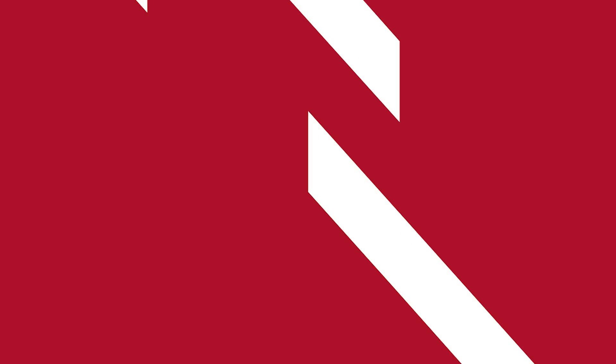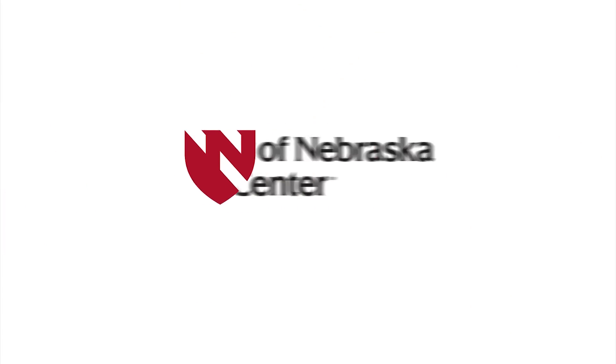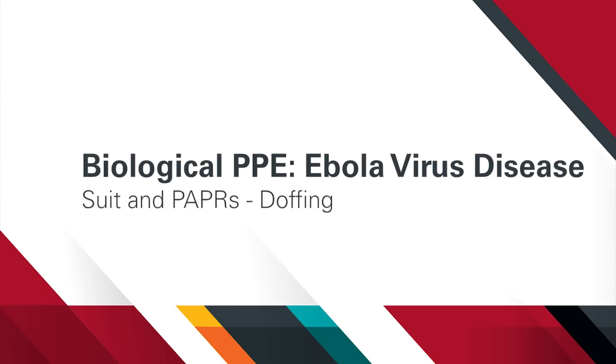In this video, we will be demonstrating the process of doffing a biological suit and PAPRs used in the treatment of patients with Ebola virus disease. Successful prevention of infectious disease transmission through the correct doffing of PPE is essential. We will walk through the doffing process used by the Nebraska Biocontainment Unit when wearing biological suit and PAPRs.